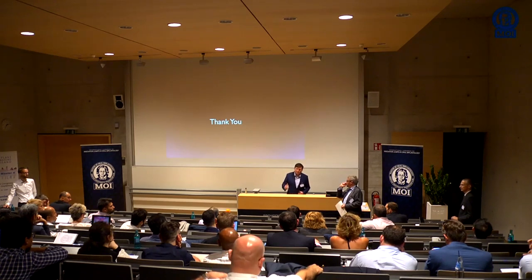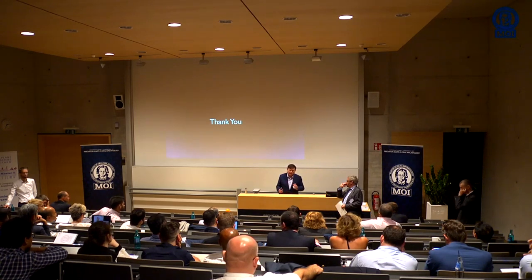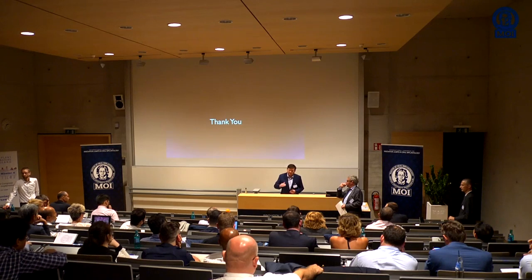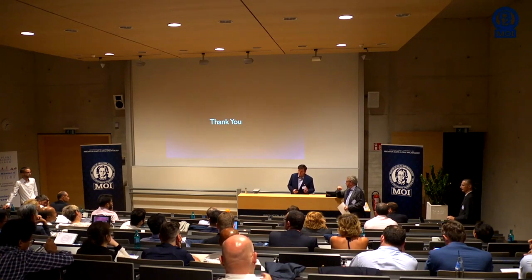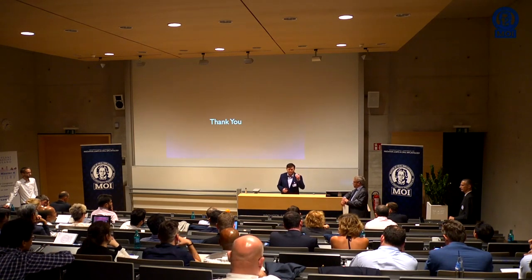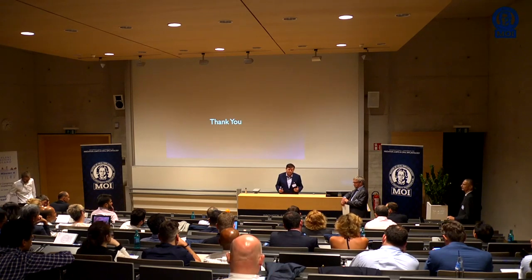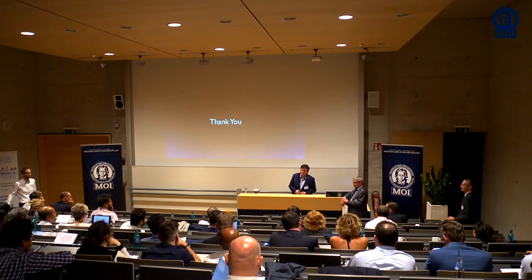Well, I think the principles that we use are the same as with digital planning conventionally for any guided surgery. But I guess I use a combination of a number of factors: the needs of the material to have enough restorative space, but also aesthetic needs. I don't want that boundary to be visible when the patient smiles. So I look for generally 10 or 12 or 13 millimeters of height off the implant head of material. But I think that's just a conventional approach for zirconium.